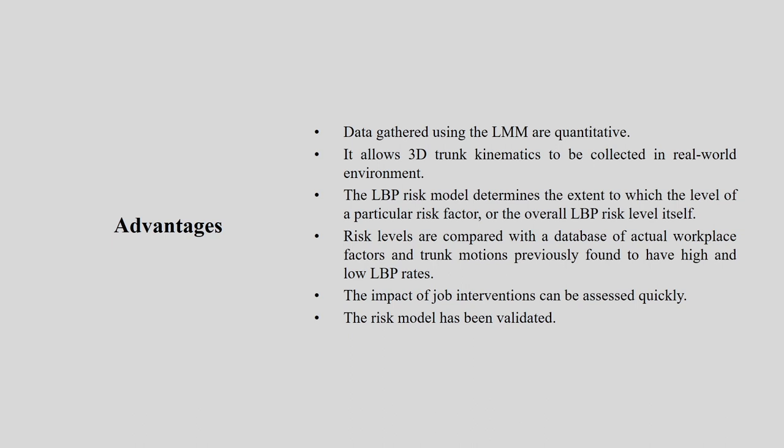The LBP risk model determines the extent to which particular risk factors, or the overall LBP risk level itself, are present. Risk levels are compared with a data set of actual workplace factors and trunk motion previously found to have high and low back pain rates. The impact of job interventions can be assessed quickly, and the risk model has been validated before you use it. So you can use this instrument for any such case, get a lot of data, and do a lot of intervention after your analysis.